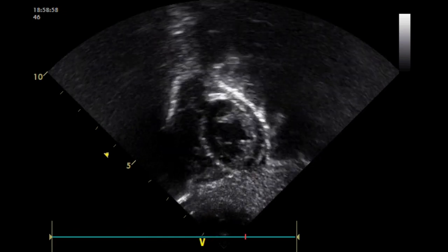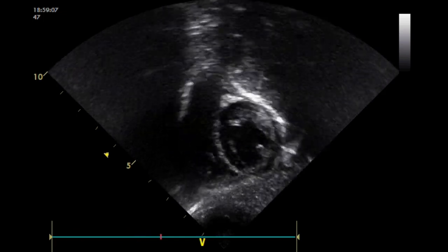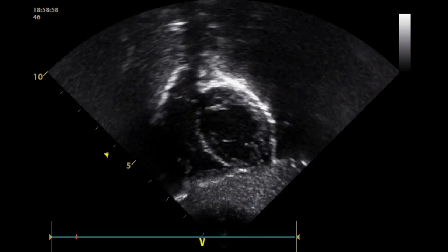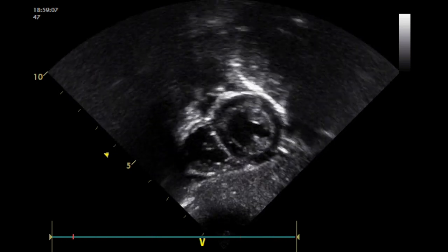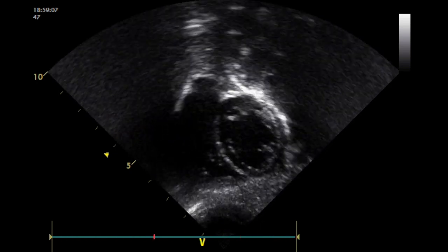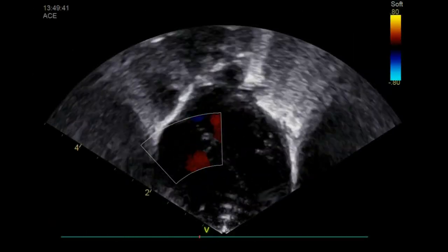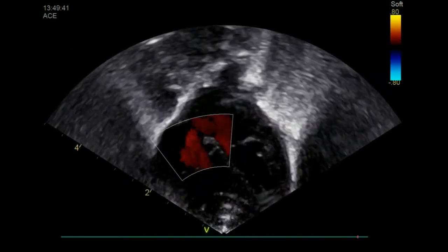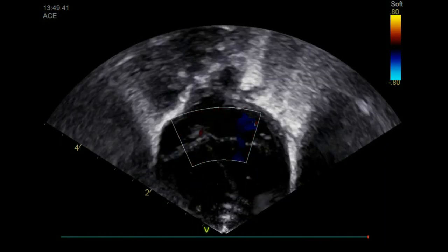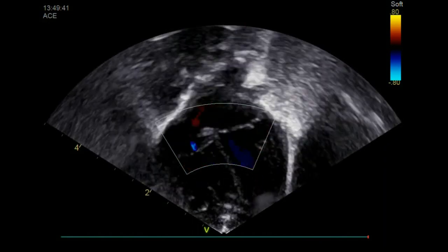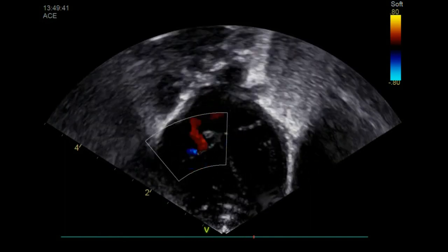This estimation of systolic pulmonary arterial pressure is not reliable in the presence of right ventricular failure or right ventricular outflow tract obstruction. It is also important to consider that tricuspid valve regurgitation cannot always be observed, and is present in approximately 60 to 85 percent of patients with pulmonary hypertension.